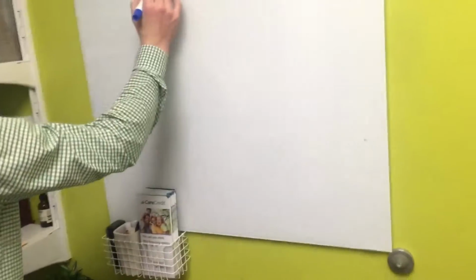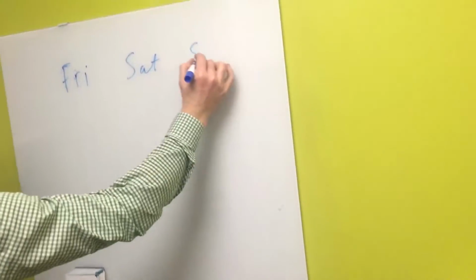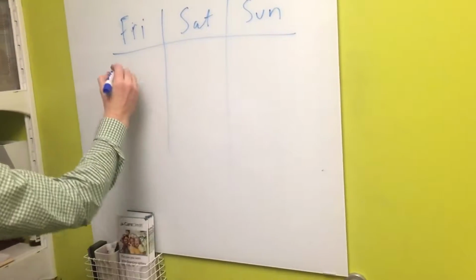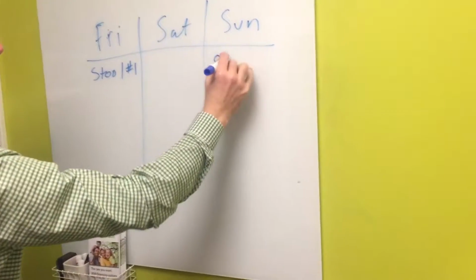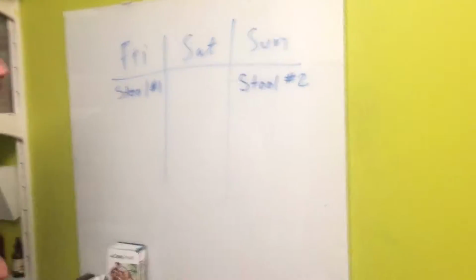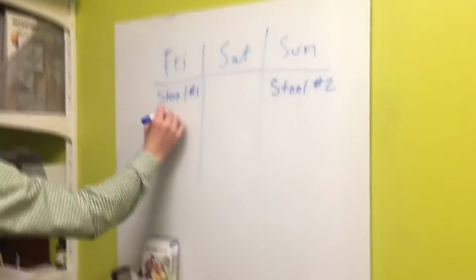So you've got Friday, Saturday, Sunday. Friday is going to be your stool collection number 1. Sunday is going to be stool collection number 2. Friday is a B vial.